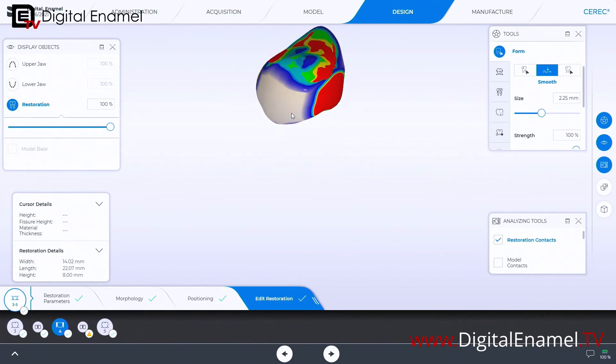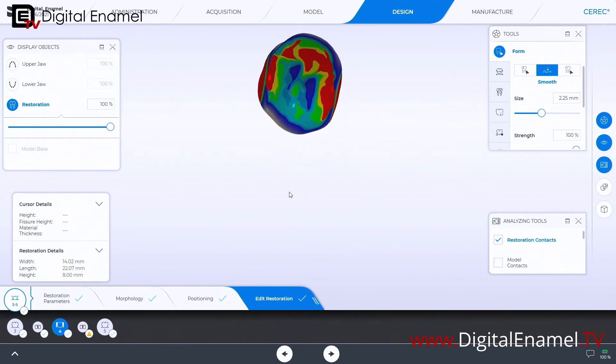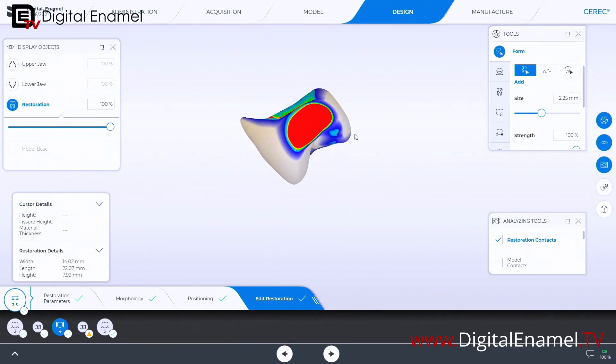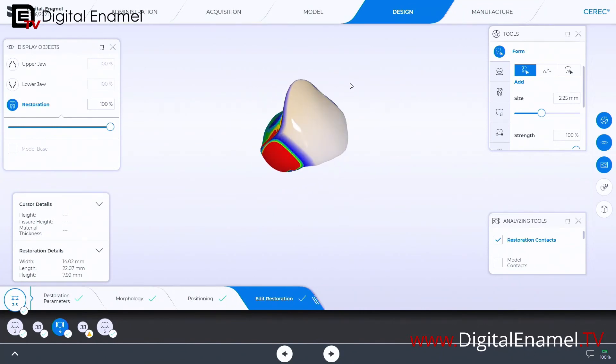Once it's sintered you can finish it back to get a little channel in there for floss. The idea is how to get this modified ridge lap — I just need a little bit more thickness to it. That's an excellent way to give it a more anatomical appearance.